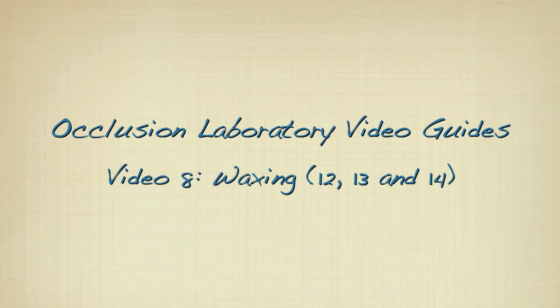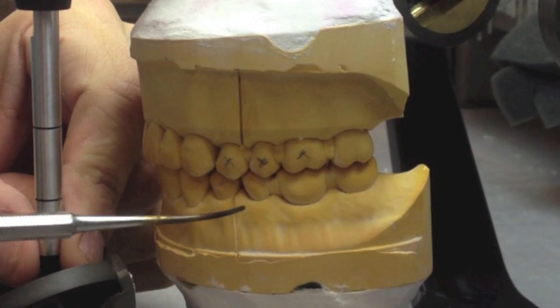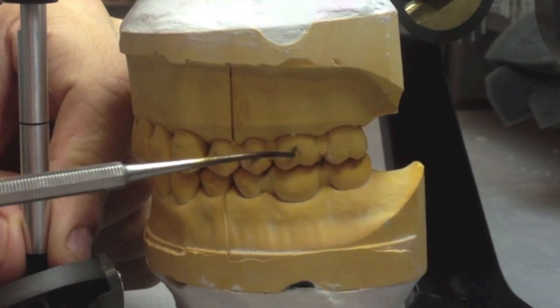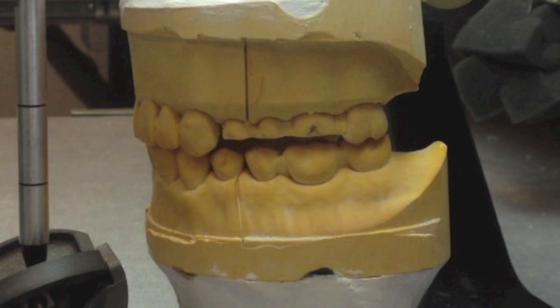Occlusion Laboratory Video Guides. Video 8. Waxing tooth numbers 12, 13, and 14. First, we will designate the proper teeth for this exercise. Then we will prep them as we have done in the past waxing videos.